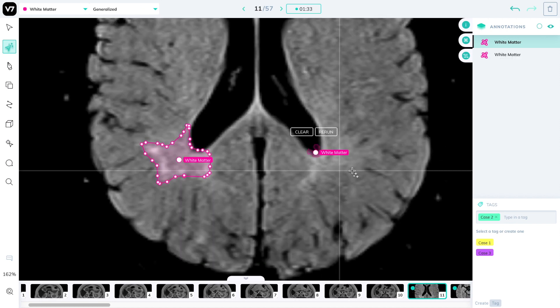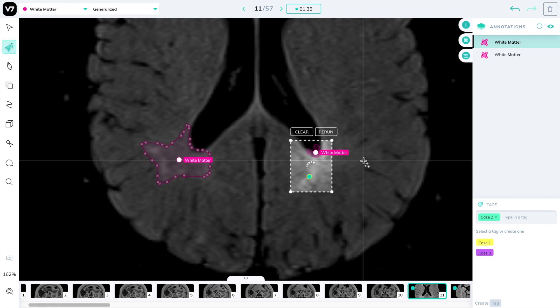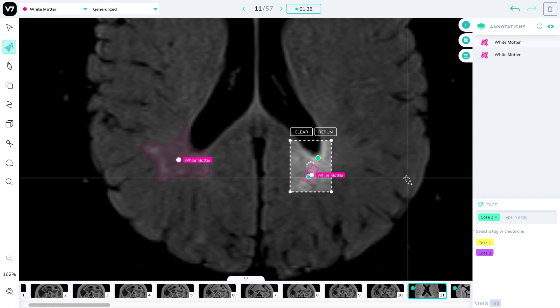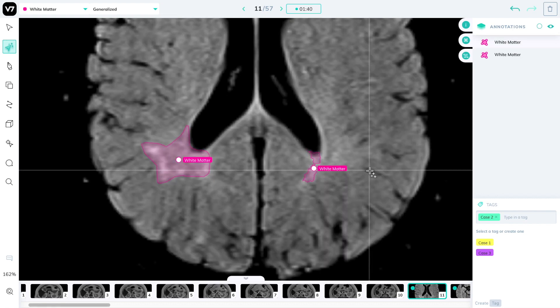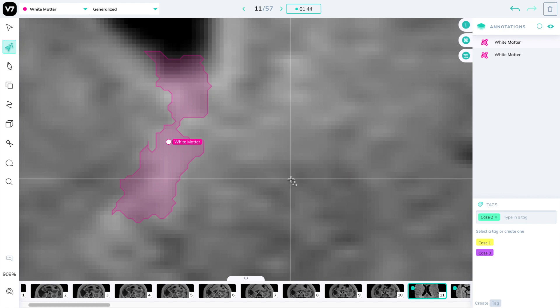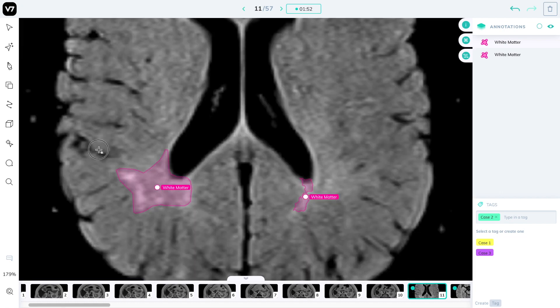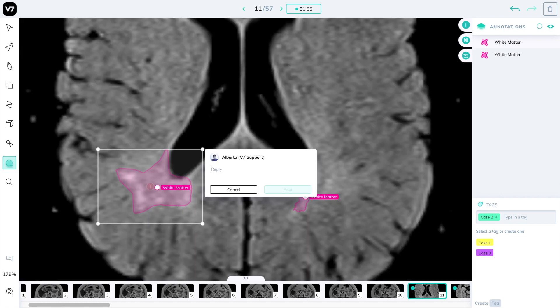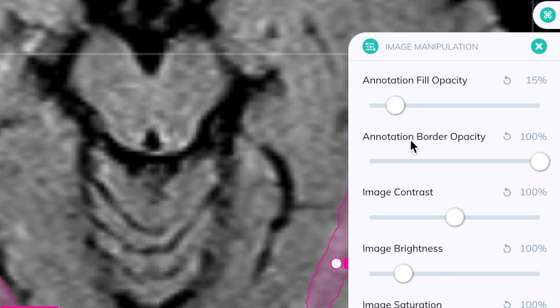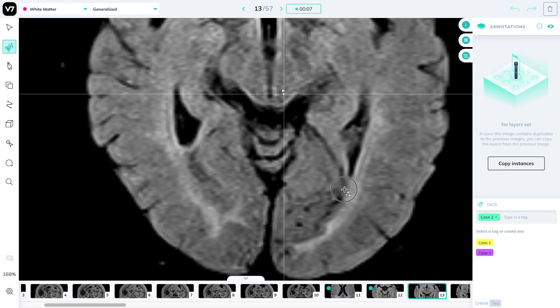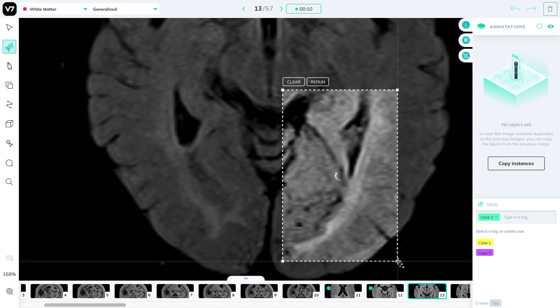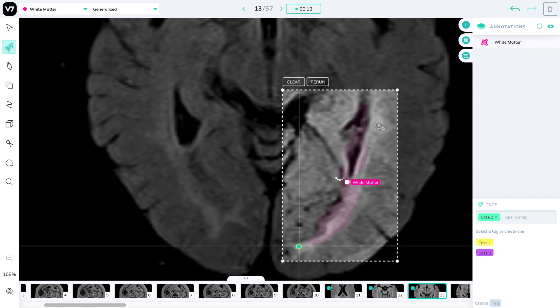Darwin tries to understand the objects you're encapsulating, such as this white matter lesion, and paints its pixels. You can click on a new area to include it, and you'll notice the accuracy is at a pixel level. You can also add comments on the images to discuss cases with colleagues. You can change the image manipulation to reduce the opacity of the annotations and see them better in faint medical imaging.